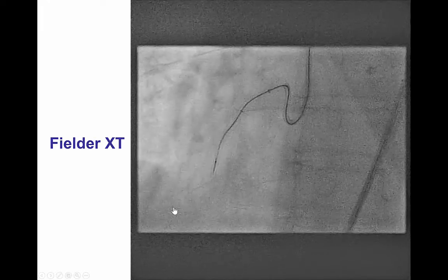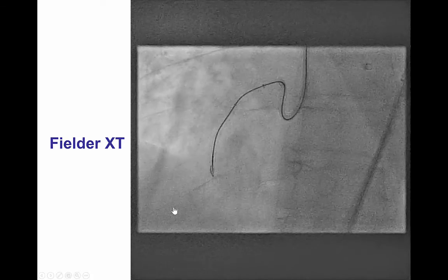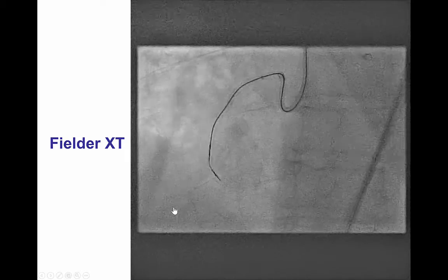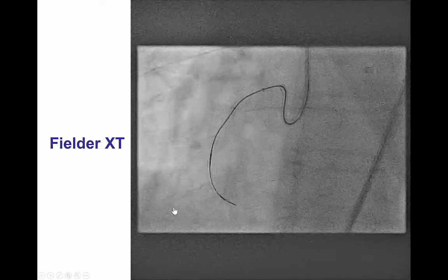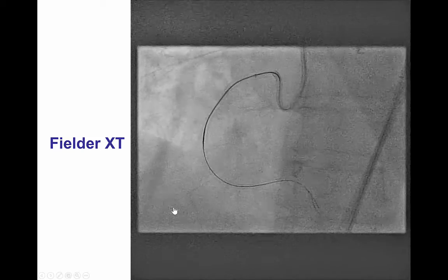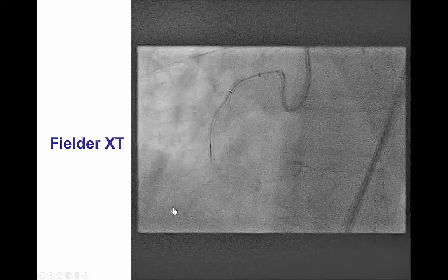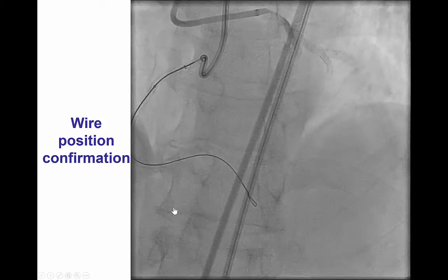After doing that, we were able to advance a microcatheter to the proximal cap and then advanced a knuckled, fluoroscopy-guided wire all the way distally.